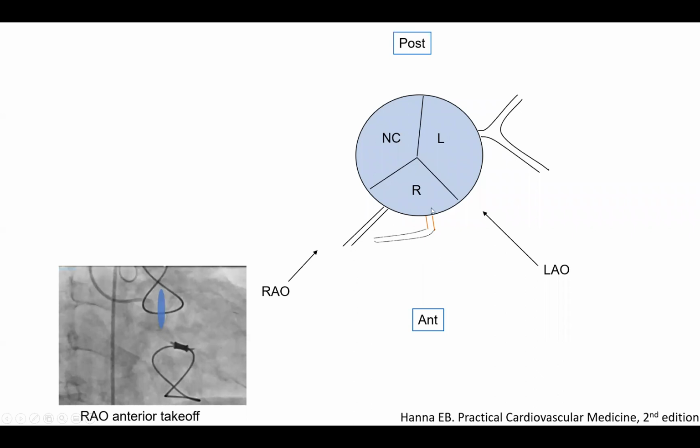So this anterior right coronary artery poses engagement challenges. And here is why. We engage in LAO, which is orthogonal to the standard right coronary and left coronary artery origins. However, when the origin of the right coronary artery is anterior, LAO will be looking at it, okay? It will not be splaying it orthogonal to it.